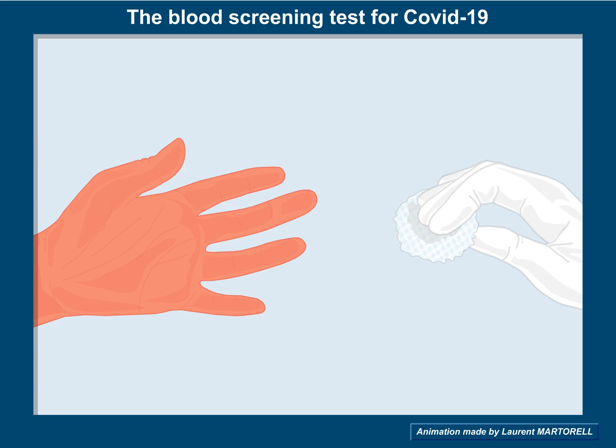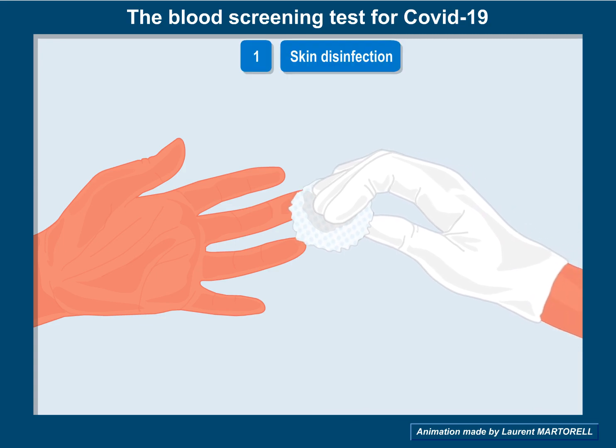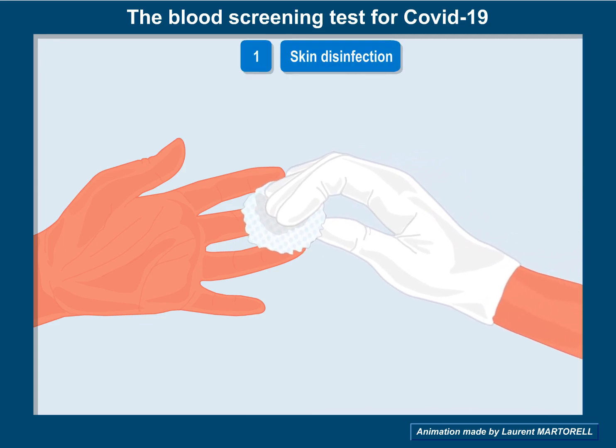A blood screening test for COVID-19. Begin with skin disinfection using an alcohol-soaked sterile tissue.